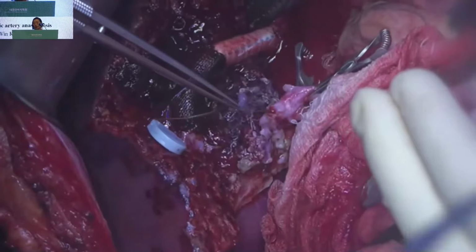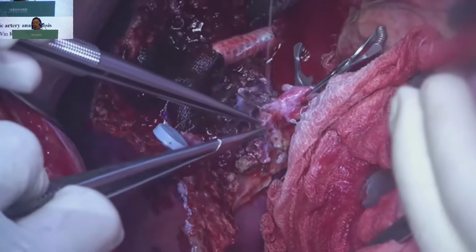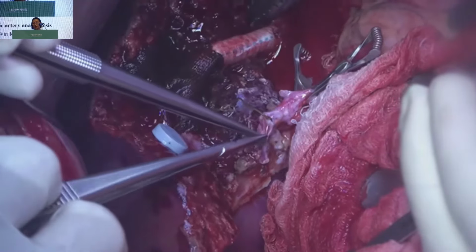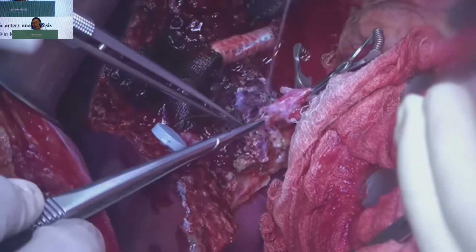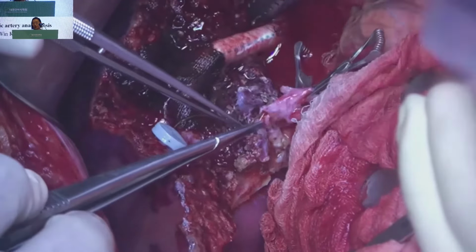Heel of the recipient. This is the toe of the donor. Left only 2 stitches.